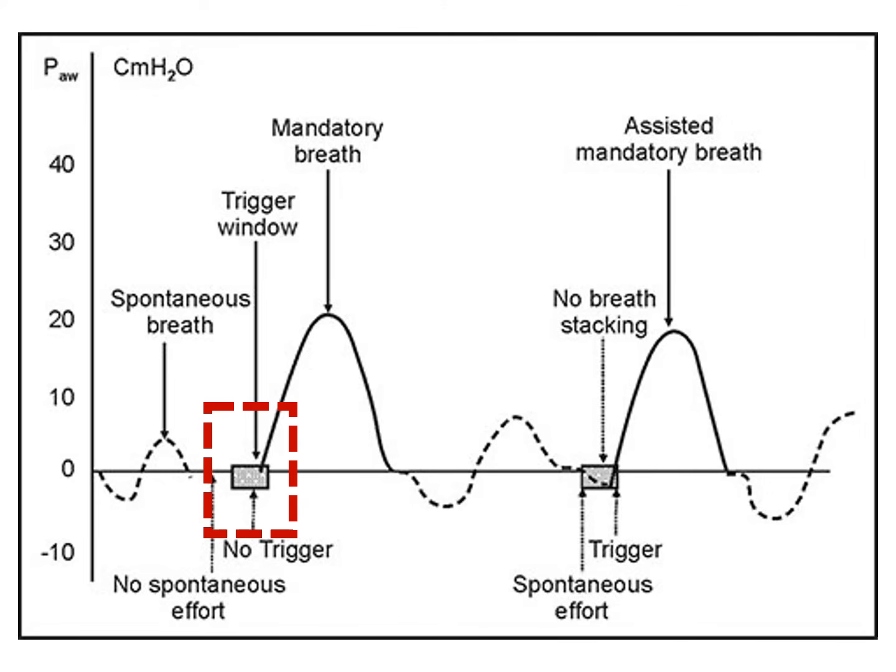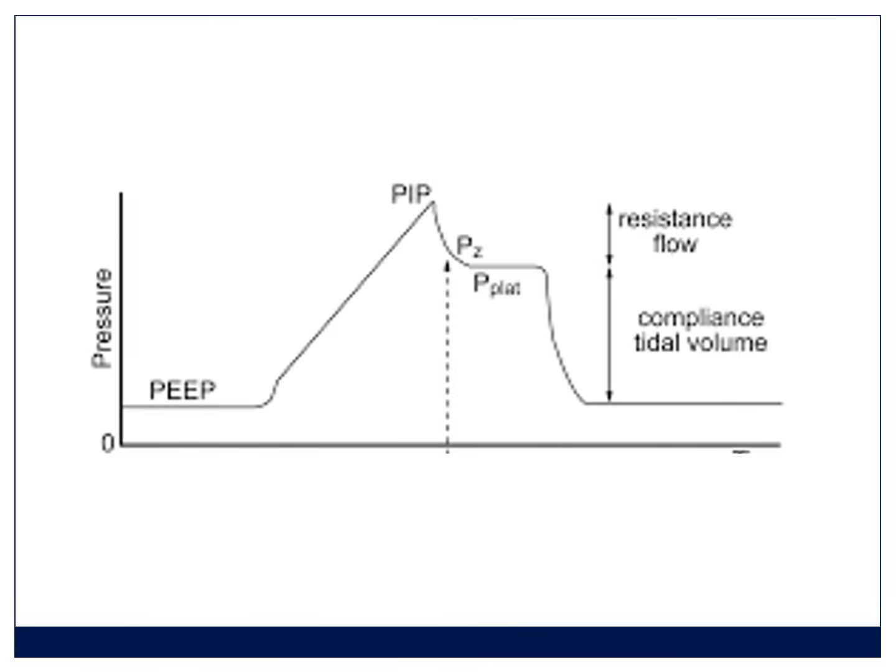The next time it happens, you see the spontaneous breathing. Now there's this little negative breath that the patient took. It went down, and then the ventilator assisted that breath. So that's an assisted mandatory breath. And that's because the ventilator is trying to deliver its 12 breaths, and if there was a breath around about the right time, it's supporting that breath. So that's synchronized ventilation, and it's something worth looking into.